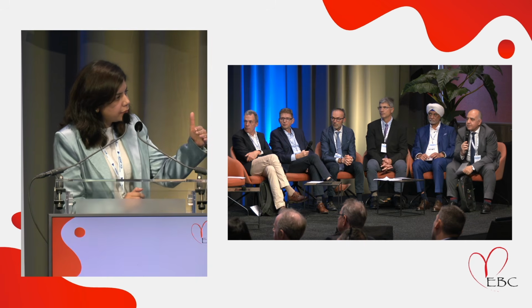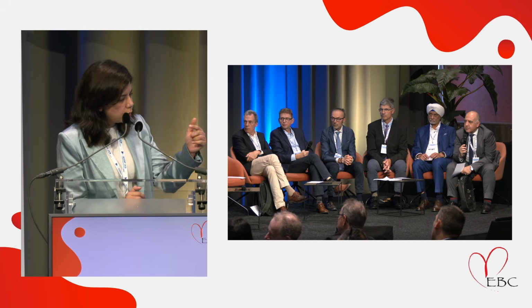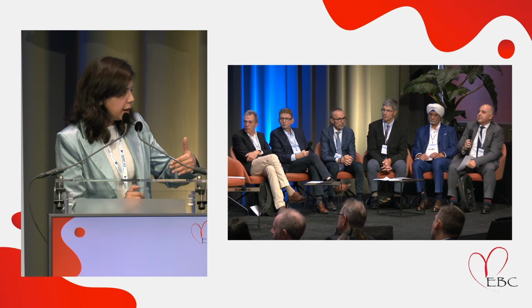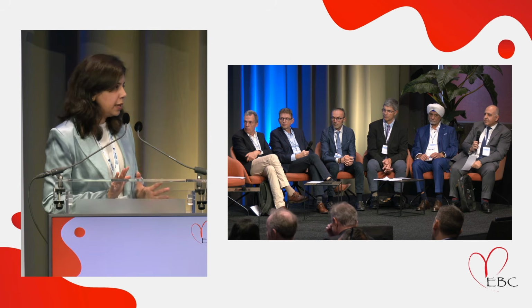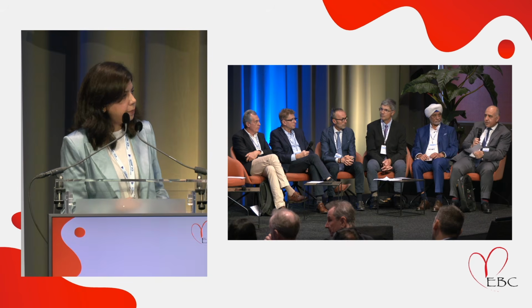Just go through the very distal cell stent strut, and confirm with imaging or stent boost that you are through. Once you are behind the stent cell strut and not through, then the strategy will change. If you balloon it, it will crush the LAD stent. So you have to be very sure that you are through. Very smart, and you used just one stent to solve the problem. Yeah. Thank you.